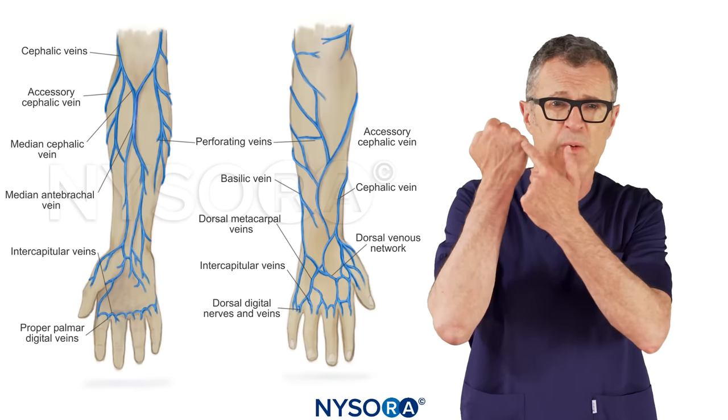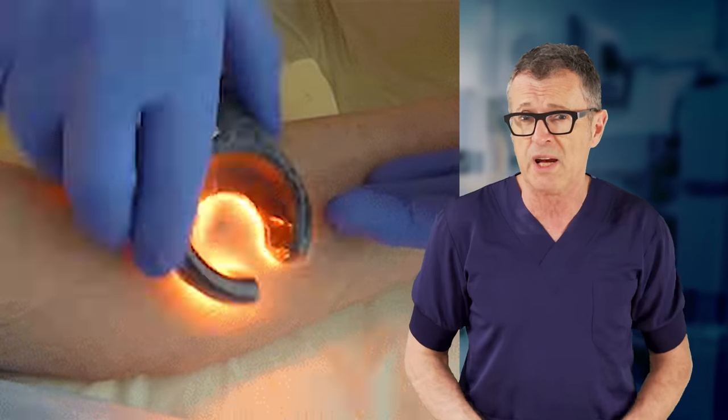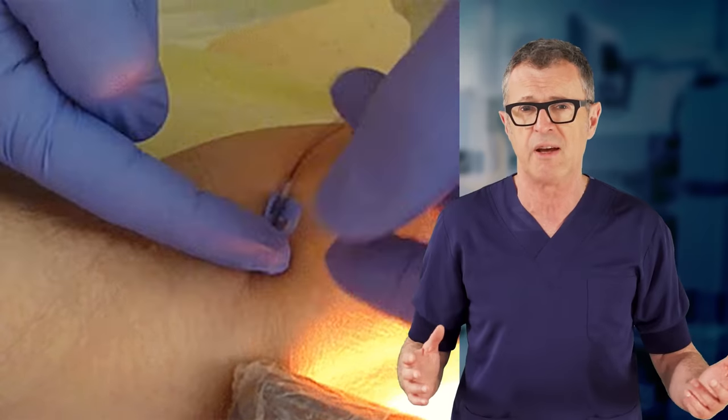Most infants have at least one vein running up to the middle of their hand. You can use transillumination to identify the veins. In this video we will feature an IV placement in the hand.